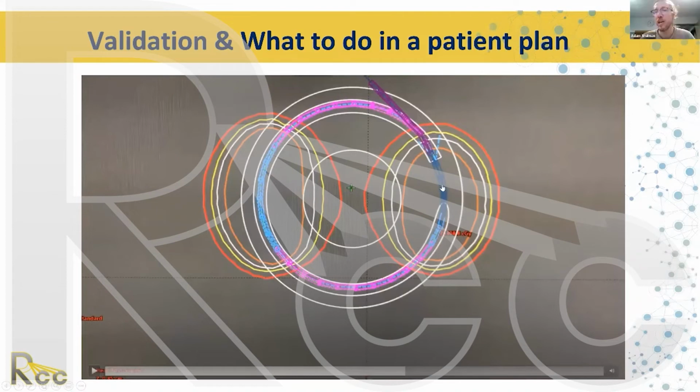Say reconstruct the tip here, and then plan with your dwell positions. Don't use your first 5mm of dwell positions as we've commissioned, and then your isodose lines in your plan would actually look the same as what's actually delivered to the patient. So again, two different methods that you can do. Practice it. Again, verification. Use an autoradiograph. Whatever method you decide to use, deliver what you think will be a symmetric delivery to the patient on film and make sure that it is indeed symmetric. That's the most important point for you to do.